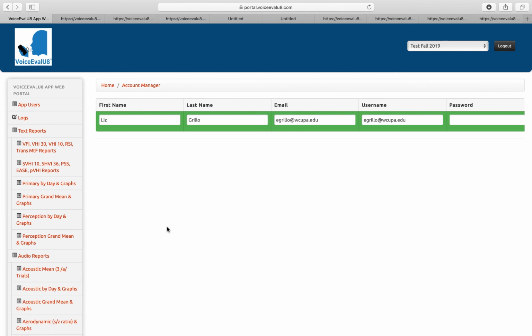So VoiceEvalU8 is really relevant now, considering the current coronavirus pandemic of 2020, where we are supposed to practice physical distancing and we need to shelter in place in many areas. So you can't meet with your clients in person, but you can certainly continue with voice assessment. You can continue with voice assessment before you start working with them during your therapy to see if they're generalizing tasks, and then of course after to document change. So VoiceEvalU8 allows you to do that remotely.